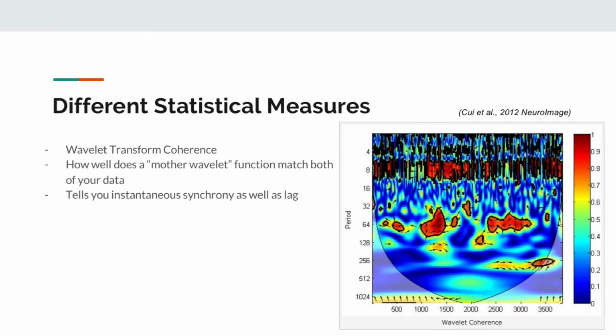That is actually, in this study, the frequency period of each trial they were having these people do. They had to, I think, try to mimic each other's button pressing at the same time, and so the prompt for pushing the button would come on at about this frequency. And so you can see periods where they were particularly good at synchronizing that and not. And the arrows indicate which data trace is leading the other a little bit.